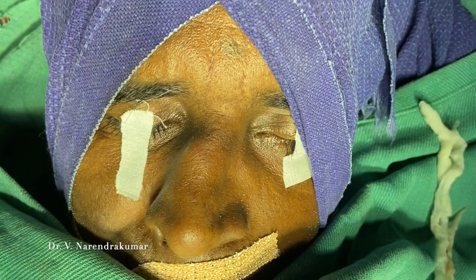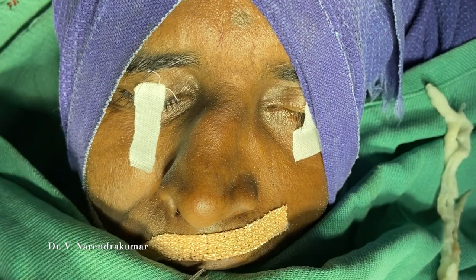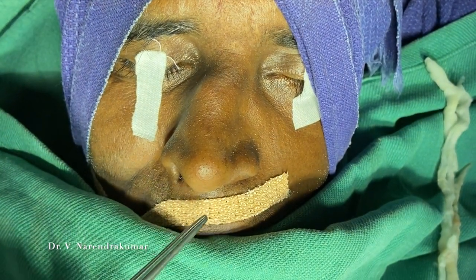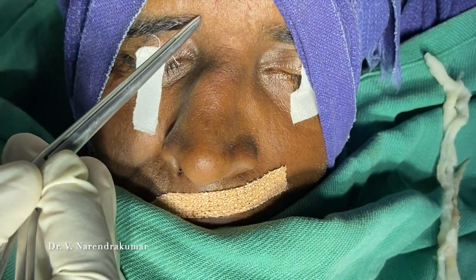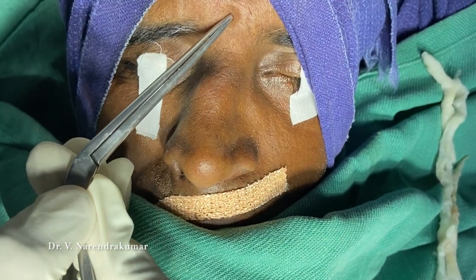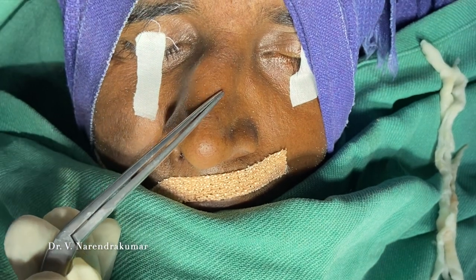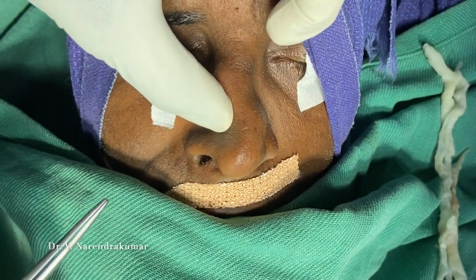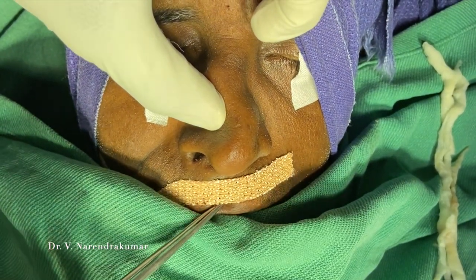We took the patient under general anesthesia. The aim is to correct the midline deviation. This is the philtrum and tip of the nose — if you draw a straight line, it goes into the eyebrow, not the glabella, showing it is not in the midline. Drawing a straight line from the glabella, the tip of the nose and philtrum are laterally placed. Our aim is to bring all three structures into the midline.